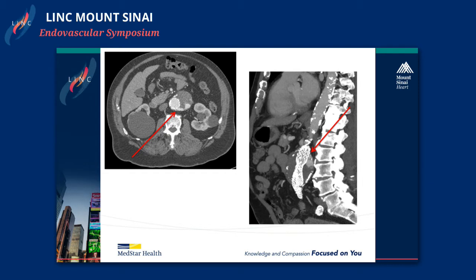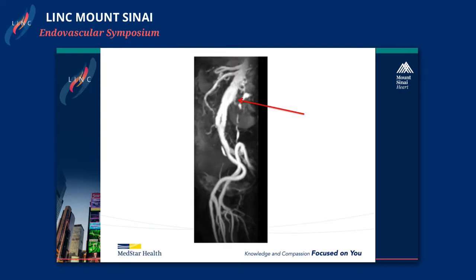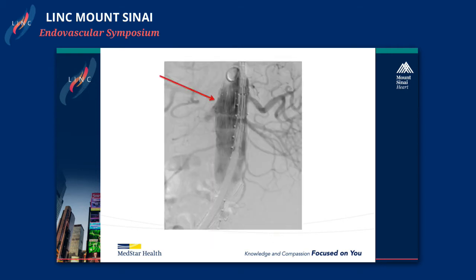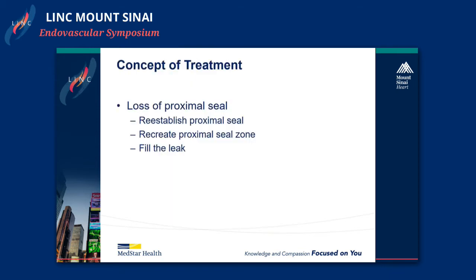You can see on this CT scan, on the axial and the sagittal images, there's obviously a lot of contrast within the sac, but you can see that it originates right at the distal aspect of that seal zone — that would cue you in that you have a type 1a endoleak here. On MR, you can see the same thing: that posterior leak right at the distal aspect of the seal. And on the angiogram, it's pretty obvious through the seal zone that there's a type 1a endoleak.